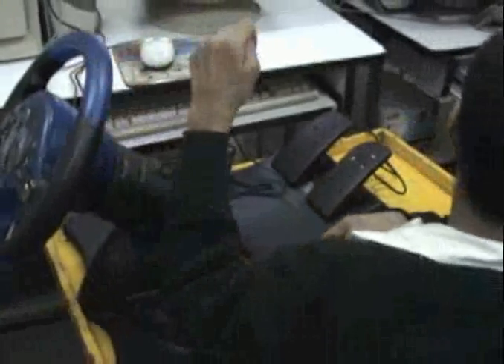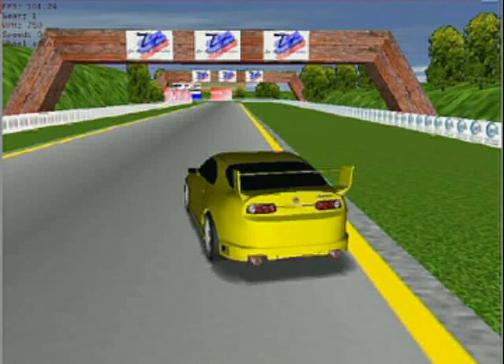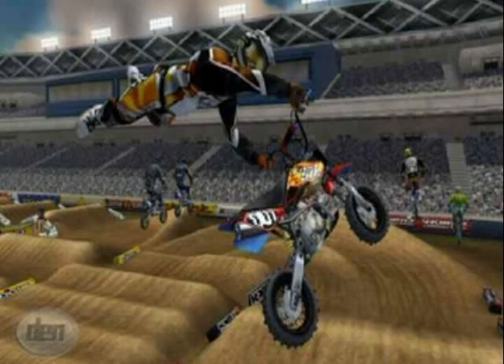The first thing that we needed to do was to find a good input device that works for him. And the one that seemed to work best was the wheel. The wheel attaches to the computer in exactly the same way as a joystick. It is preferred by gamers when racing cars or motorcycles, and it is also very useful in navigating Google Earth, and so on.